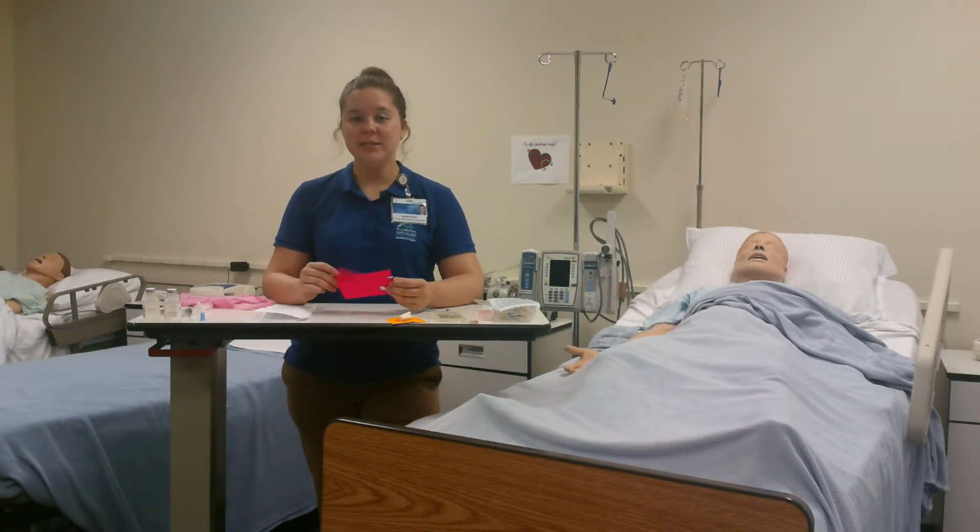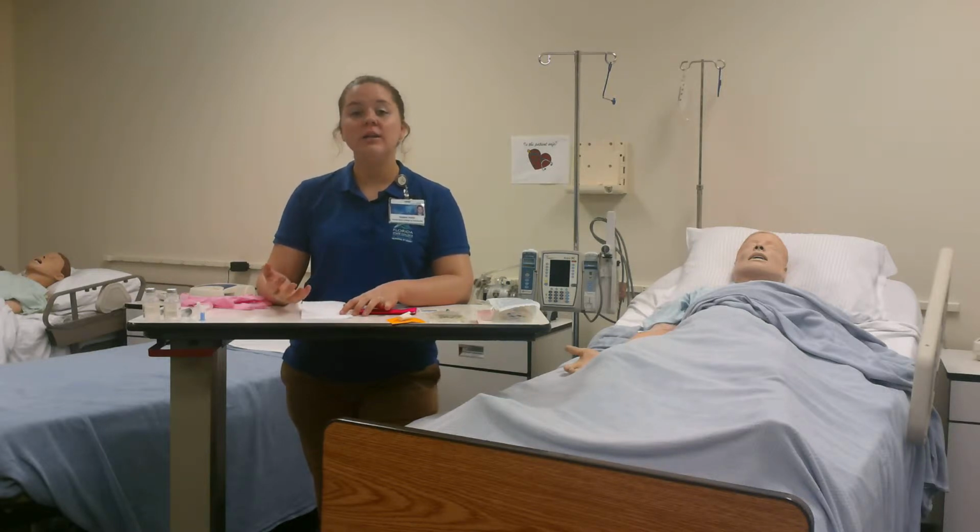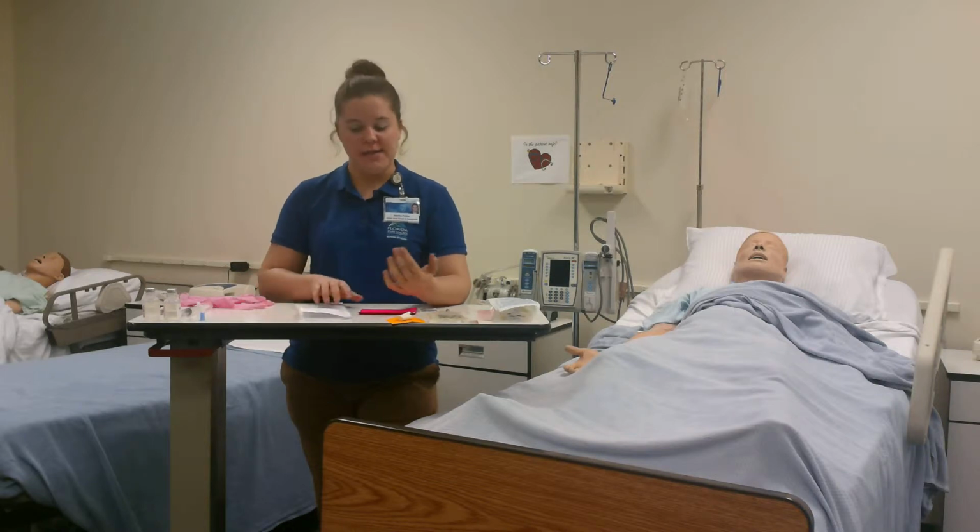Potter, and today I will be demonstrating how to do an IV piggyback. First, we are going to take a look at our doctor's orders on the MAR, which include the correct dose, the correct route, and the correct frequency. And we're also going to look at any labs and any allergies our patient may have.